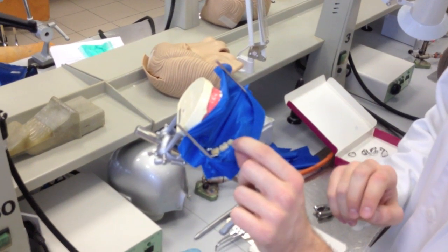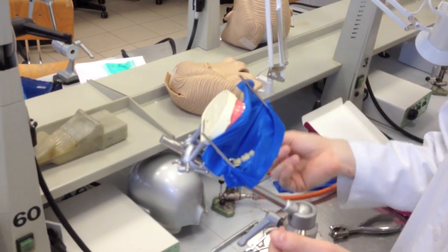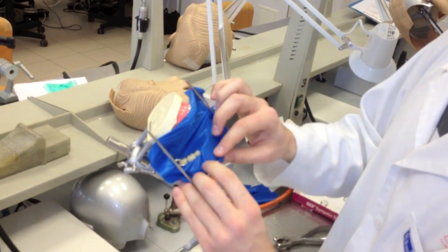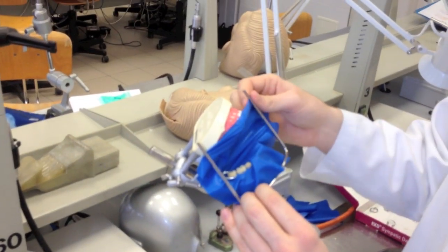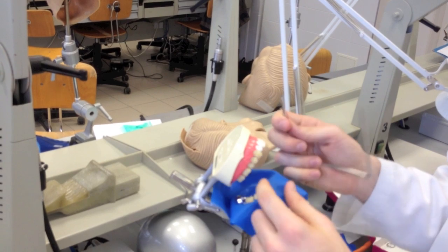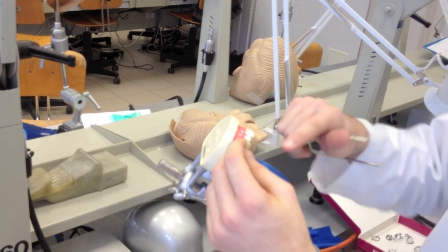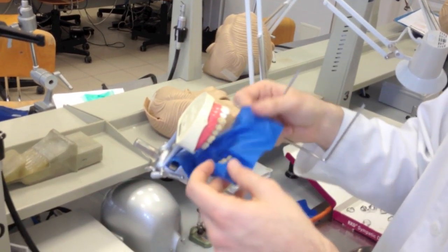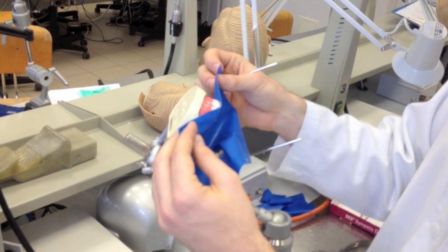This was option number one. To remove it: first, if there's any wedge or rubber ligature, remove that. After that, remove the frame. It's important that if you did some root canal treatment or preparation, there may be some liquid in the rubber. Before you remove the frame, dry it with a cotton roll, because if you remove the frame you could spill it — it can go to the patient's mouth or clothes.